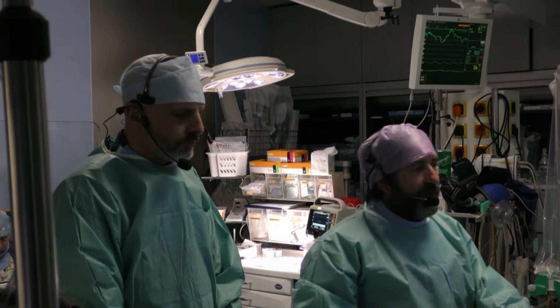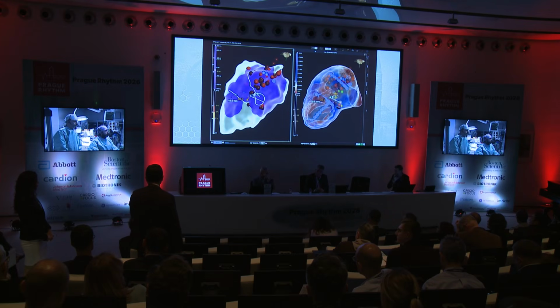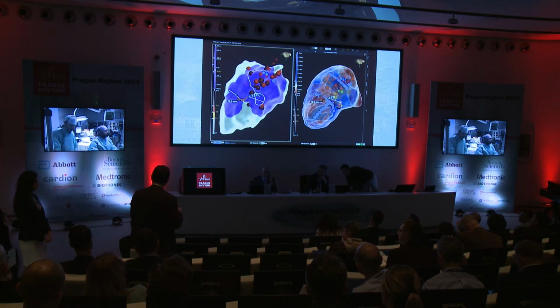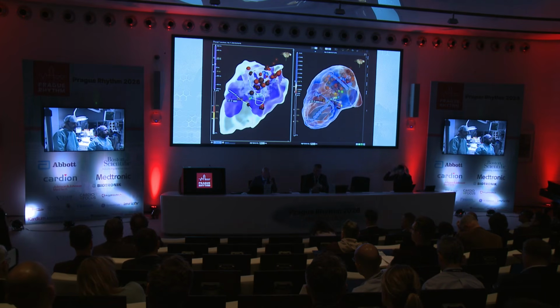I understand, yeah. But what I'm trying to say is there's no way you can make it any faster by ablation. So you've created slowness, and the system annotates the near field electrogram. So if there's no near field, it'll make the appearance of faster, but it really isn't faster. It's slower or nothing. So I think the map looks different to what reality is. Yeah, probably. It's an interpolation of activation, and the near field, far field, picking up something different.